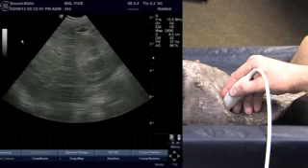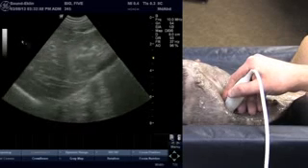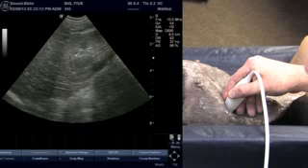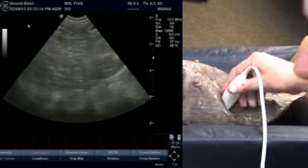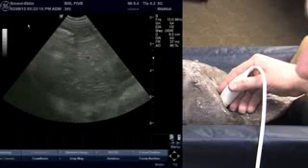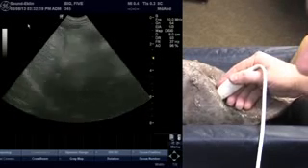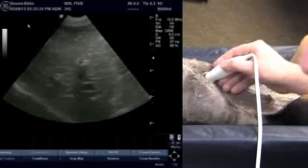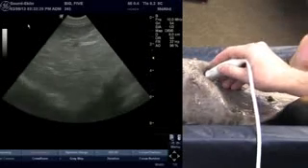And my stopping point on the right side is typically when I get down to the area where I can pick up the kidney and the liver, and we see where that kidney is in that renal fossa. And we'll come back and talk about that when we get to kidneys. At this point, we're going to continue in a sagittal plane, and we're going to go back up towards midline, again picking up the gallbladder, and then we will sweep over towards the left side.